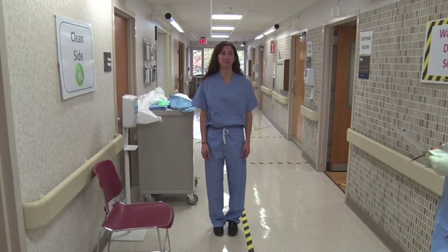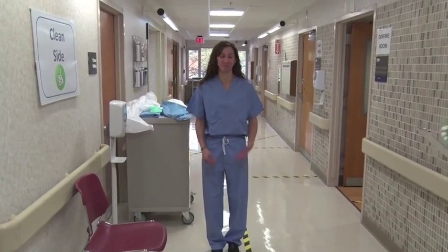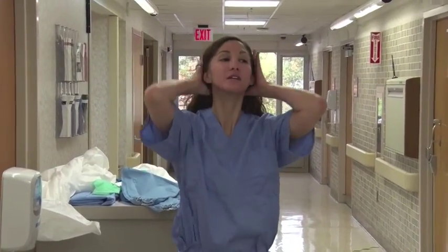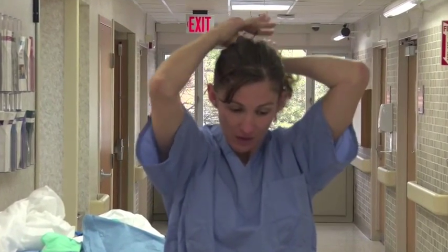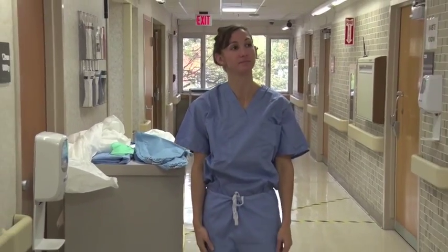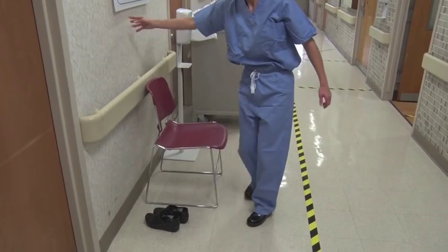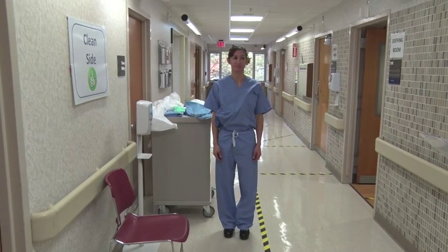This is the healthcare worker donning procedure. Change into hospital-issued scrubs. Remove jewelry and all personal items, including cell phone and name tag. If you have long hair, pull it back and secure hair up and off the neck and the back. Change into hospital washable shoes. Perform hand hygiene.